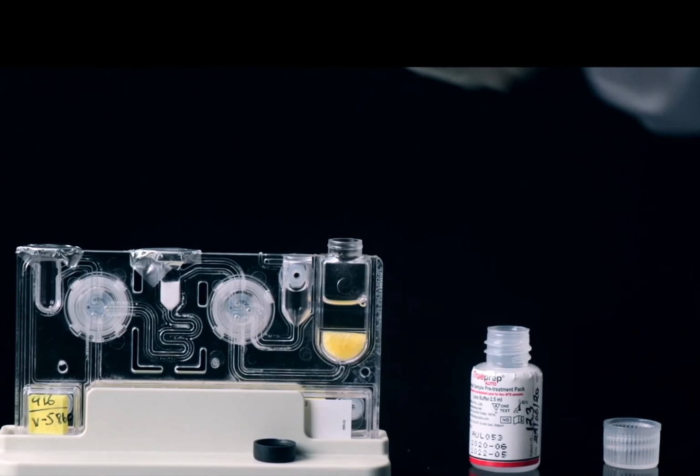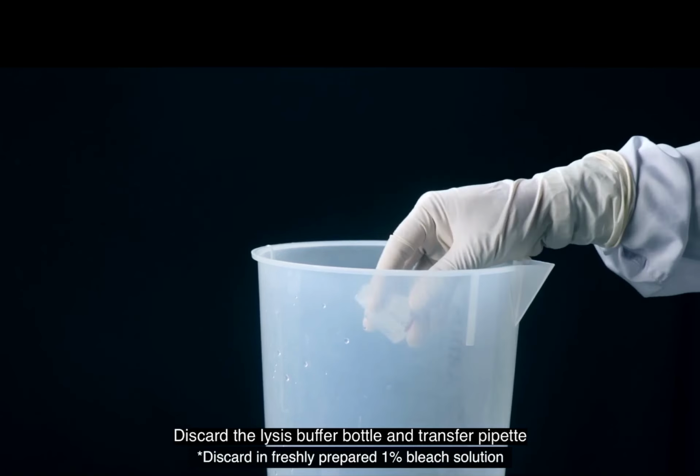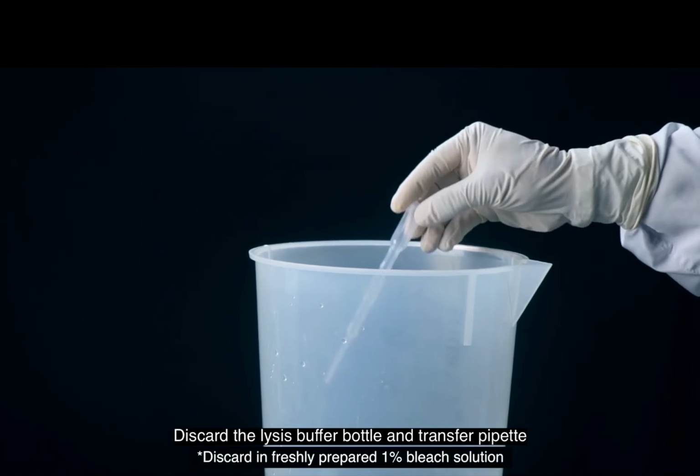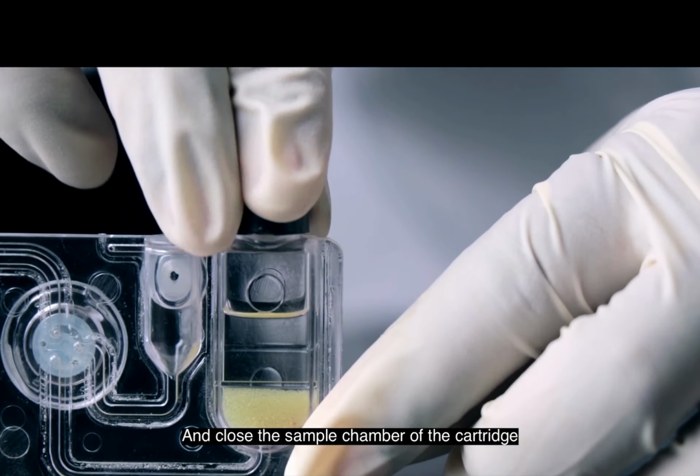That is very important. Even if an air bubble is formed, if you slightly flick it, that air bubble will go. Now you dispose both that bottle and your 3 ml pipette. There's no use of it. Now close this particular thing.